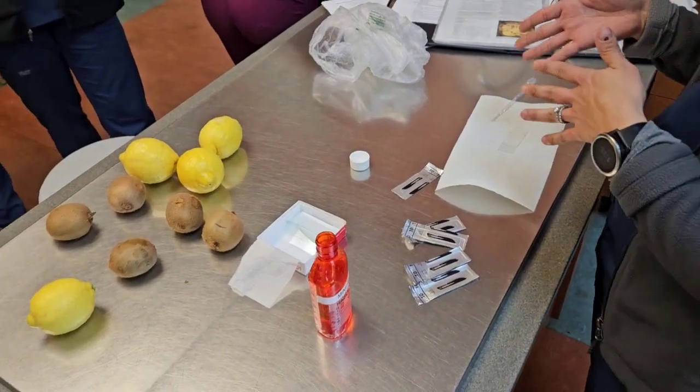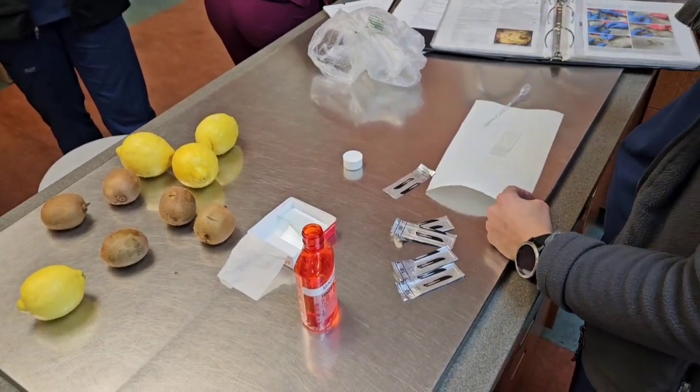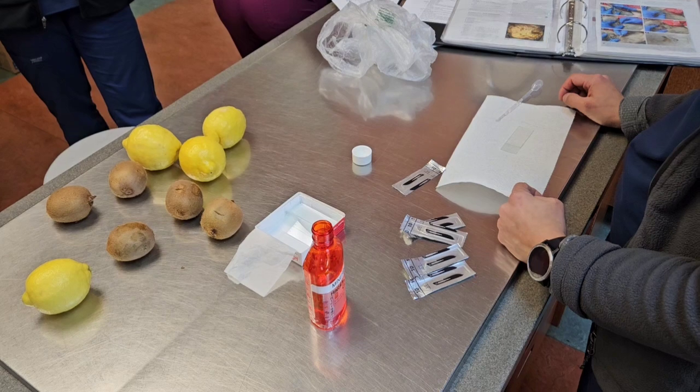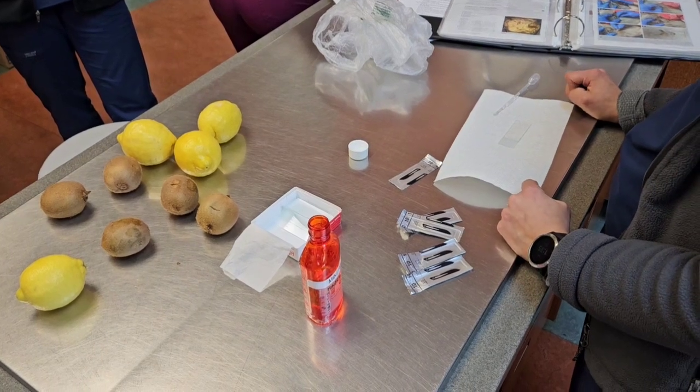I'm going to talk about how to perform a skin scrape and then also how to read one. Can anyone tell me the two types of mites we find with skin scraping?